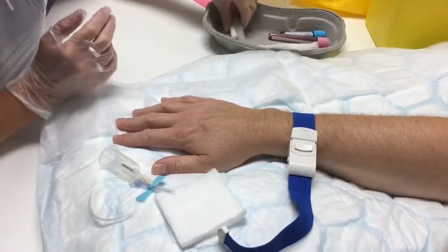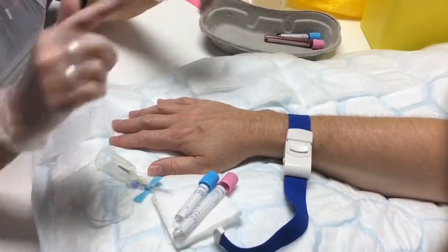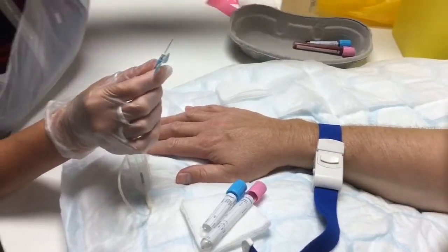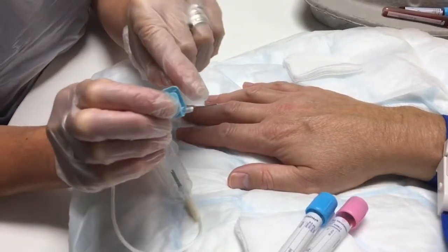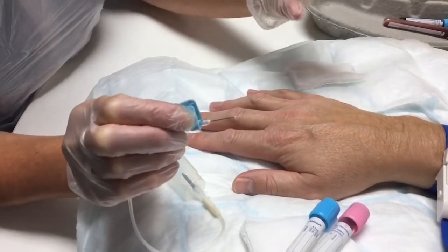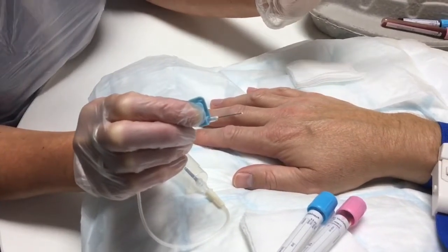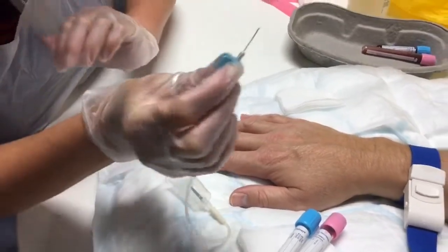We need that to air dry as well. Make sure you've got your gauze, your blood bottles, tourniquet on. I'm going to unsheath the needle and show you it. Again, your bevel has to be up — it's a much smaller needle, good for people who haven't got great veins, good for children, good for older people. So this can be a really useful device.